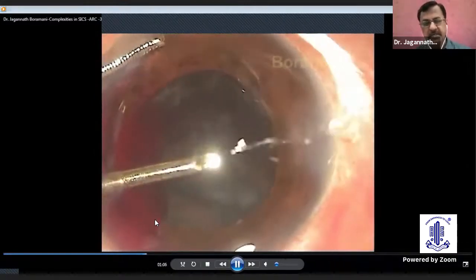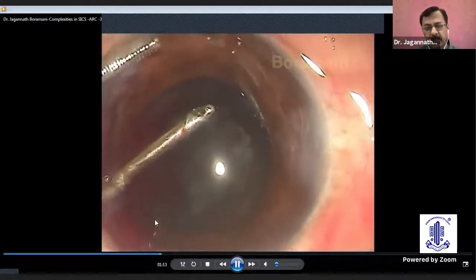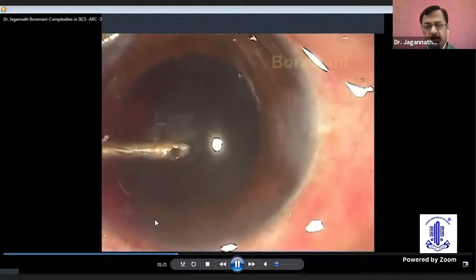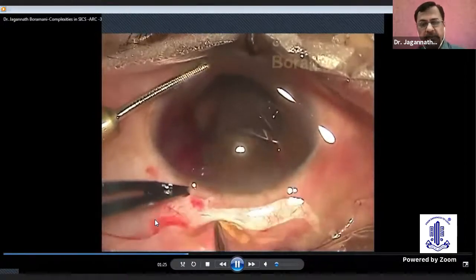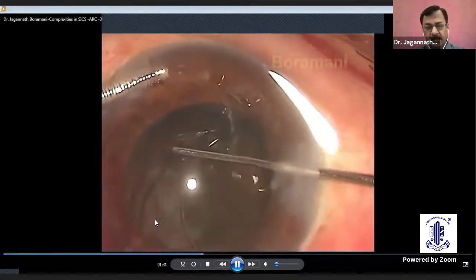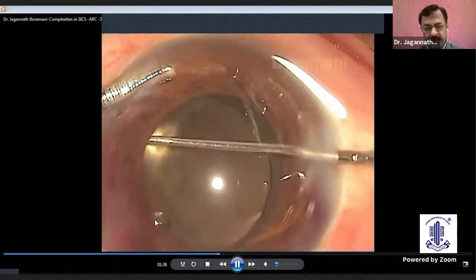The point here to note is that now all the forces applied in the capsular bag are towards the area of the disinsertion, and not to apply any pull in that region. So even during the cortical aspiration and IOL implantation — for all the steps — the forces are applied towards the zonular insertion. Now I am putting the intraocular lens, and here I am using the same lens itself as a CTR, because now the lens will give support to the capsular bag. The lens is not rotated; the insertion also is towards the area of the zonular dialysis.